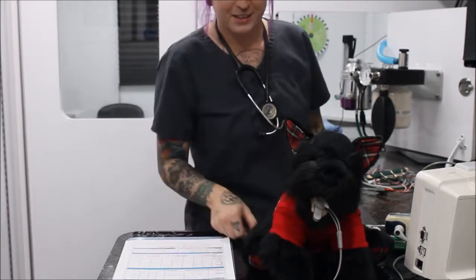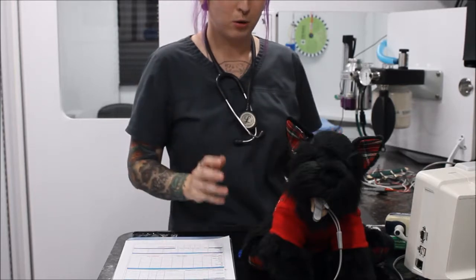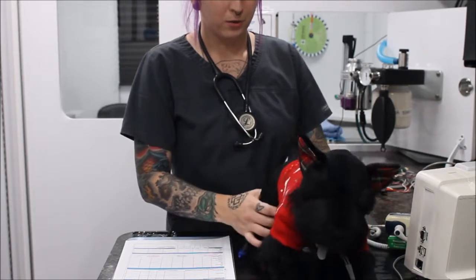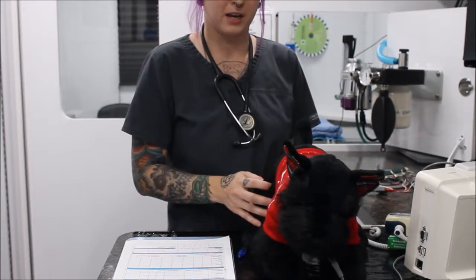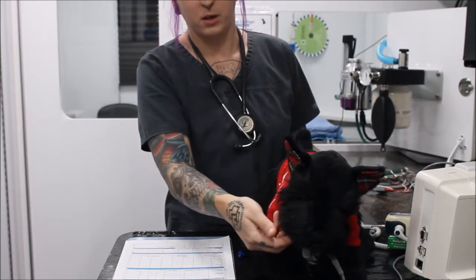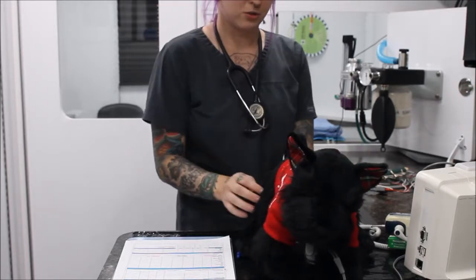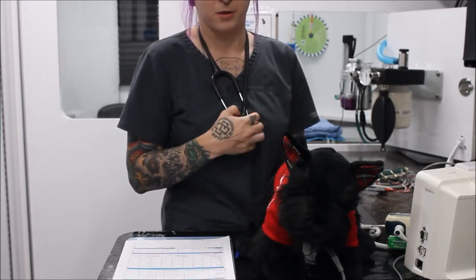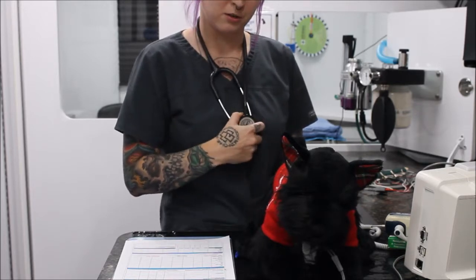So now we'll go on to talking about pulse and blood pressure. Pulse strength is a good indicator of blood pressure. So we do want to measure the pulse strength, and usually we'll do that at the femoral arteries. You can also do it at the lingual, carotid, chest, and ear, but usually femoral. We want to feel for a pulse, and then we also listen to the heart rate. We want to make sure they match up evenly, and that should be done before surgery. You can also do it during surgery.